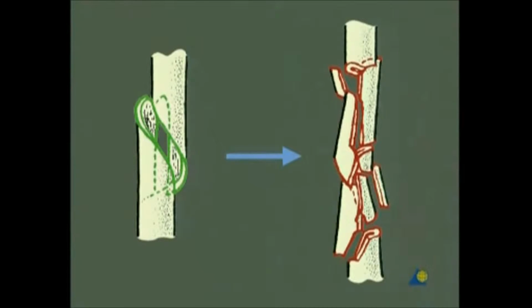For example, in the case of femoral shaft fractures in combination with ipsilateral fractures of the tibia and or the patella, in the presence of proximal or distal endoprosthesis, and in cases of adipositas per magna.